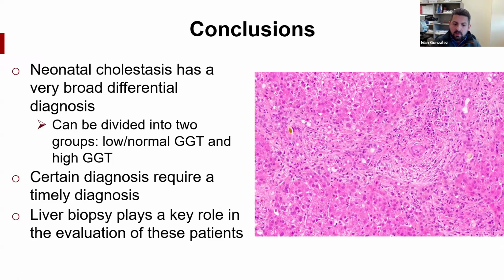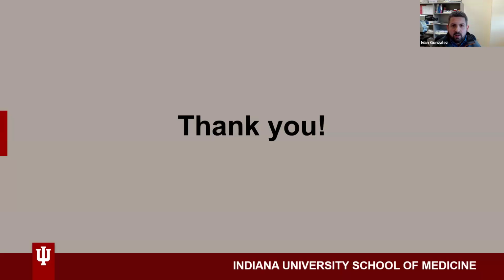I should emphasize, and you probably saw that based on the differential diagnosis of each pattern, you cannot diagnose BA on your liver biopsy. You should diagnose the histology pattern that is associated with BA, and the clinician needs to keep doing their workup. Liver biopsy plays a key role in the evaluation of these patients. When you see these liver biopsies, identify the pattern, and that's how I usually sign them out. I just call it the pattern and signal my differential diagnosis. And with that, thank you so much for your attention, and I'll be happy to take any questions.